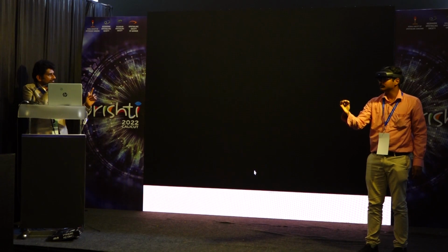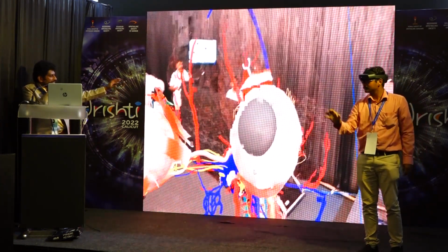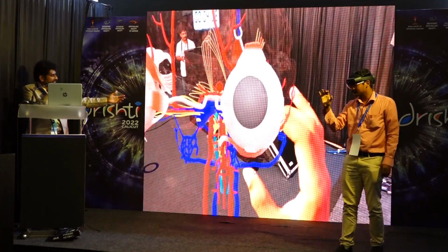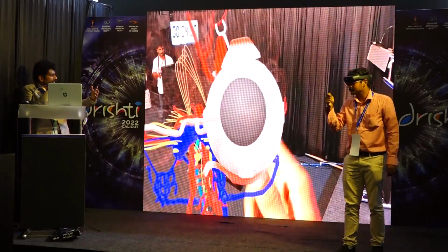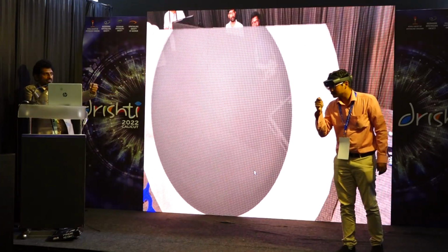Yeah, Tenzing, we just have a small glitch. Yeah, we are back. So this is the whole brain, the whole neural anatomy that we have also re-engineered or reconstructed. Can you have the hand stationary like a direct ophthalmoscope? Yeah. Move into the eye. Yeah. So this is a direct ophthalmoscopy simulator where you can move towards the patient's cornea.